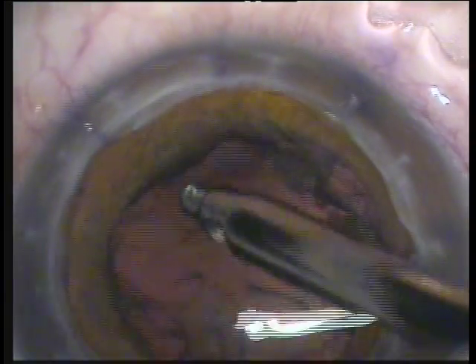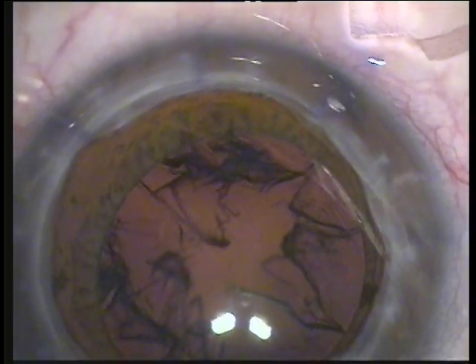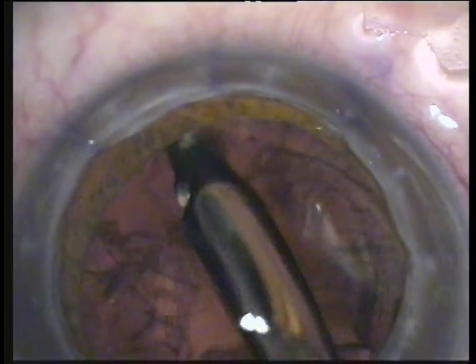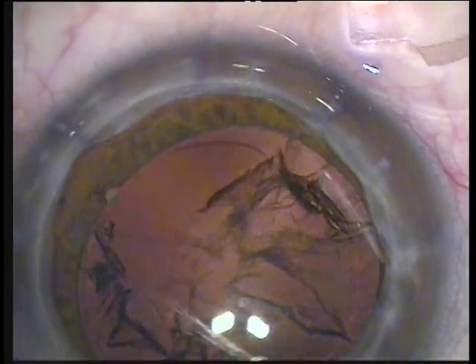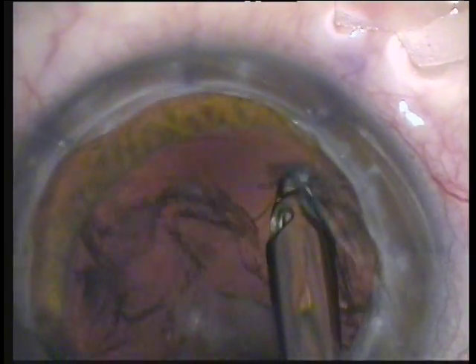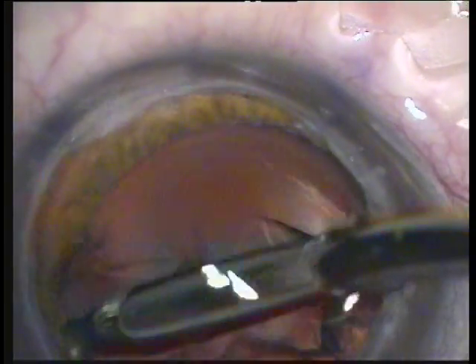In my opinion, this is a crucial step, as posterior capsule opacification in the combined procedure is quite challenging to treat with YAG, as it takes quite a while for the cornea graft to become clear and enable efficient YAG capsulotomy. This is performed open sky and you can appreciate that the visualization is challenging due to the water streams coming out, although special care should be taken to always manipulate cortex carefully and avoid grasping the anterior capsule or any of the posterior capsule.